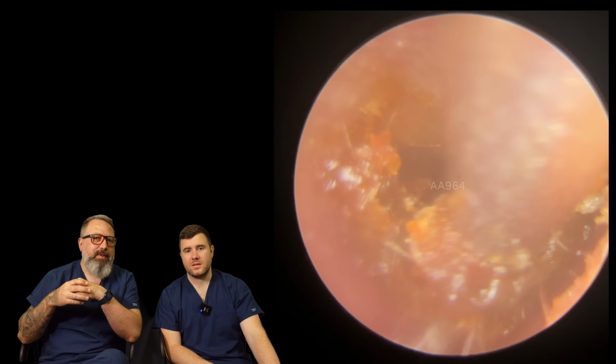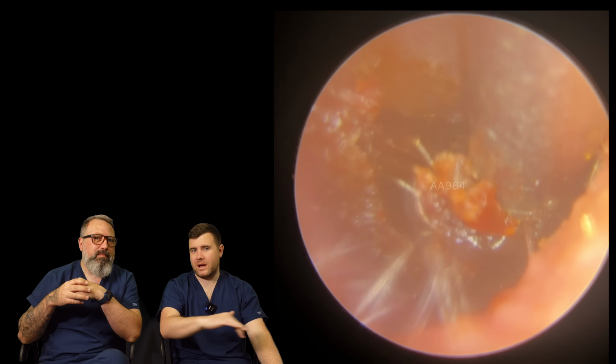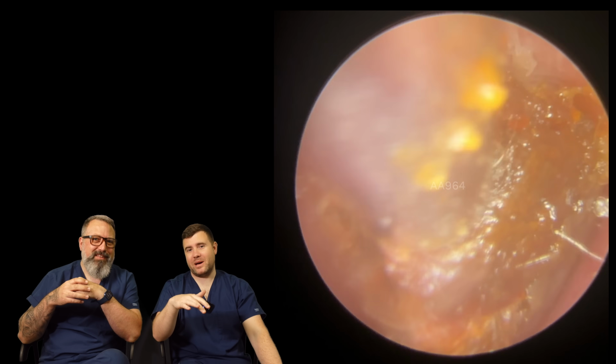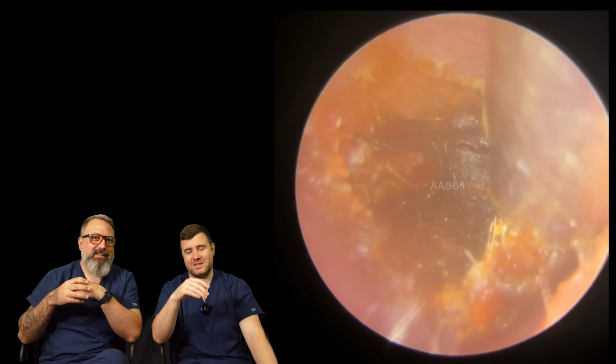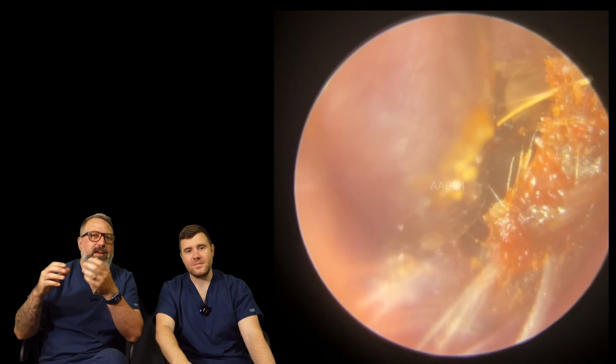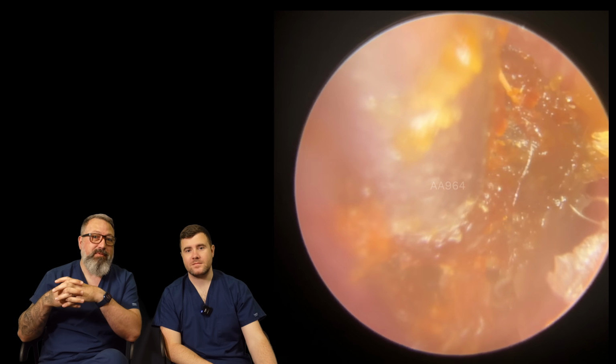So he's lifting this up now. Yeah, sometimes you'll find it'll just squash it all back against the ear canal. If you haven't used any oil, it will just stick itself back to the ear canal. Just makes your job twice as hard. Yeah, because you're working on very thin layers of wax and trying to peel those off the canal. Whereas if you've coated it beforehand, it just falls to the canal, but you can lift it off really easily with a bit of suction.